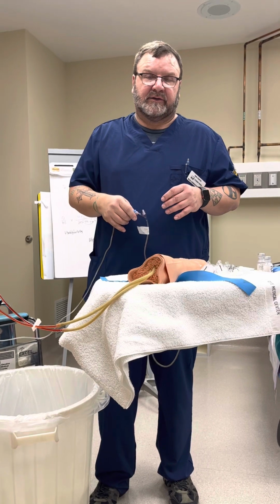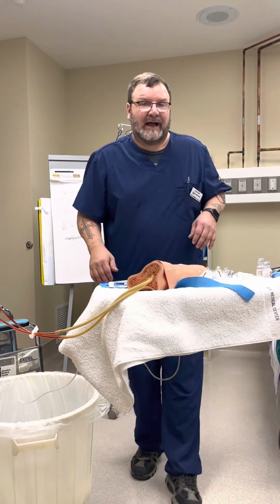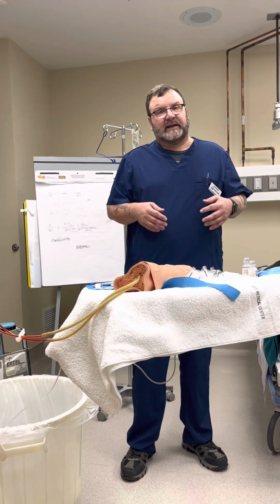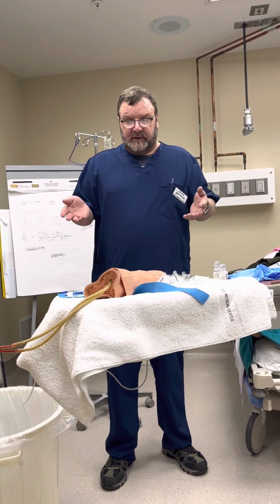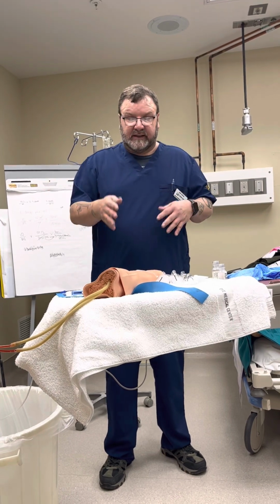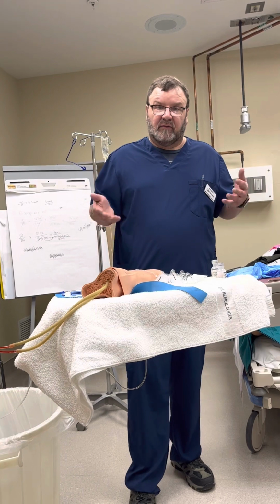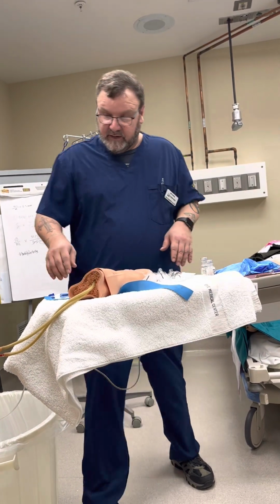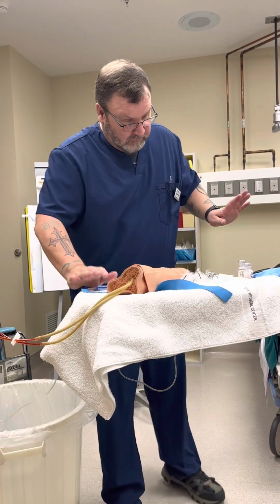She has her 2 liters of solution that she's gotten. I have now gotten an order to saline lock her. So we're going to complete this process and leave the IV in place. So I would make sure she understands what that is, what we're doing, make sure this is closed up. We're closed up.